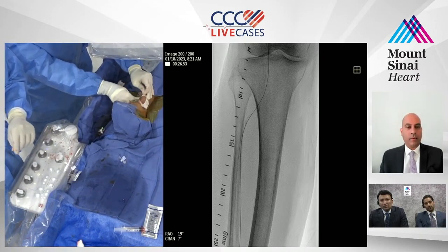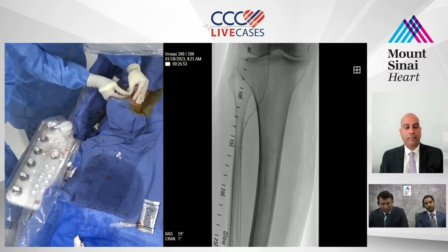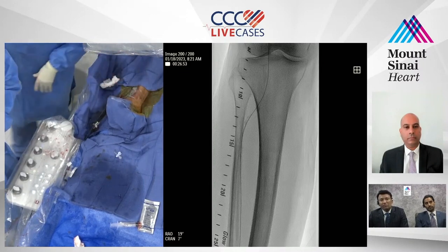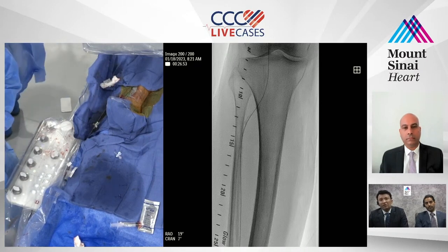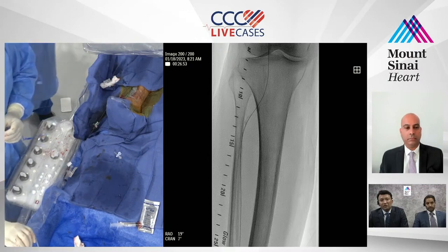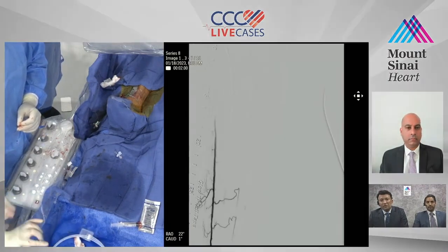Oh, no, 035. I'm saying just to define it better, like what's happening in that area, like how is the occlusion behaving? So that we can have a roadmap. Which occlusion are you talking about? No, I'm talking about the pop and the distal SFA. Yeah, well, we have a picture. Let me show you. We have a few pictures right here. Hold on. Let me cross this with everybody's help, and then we'll talk about how we're going to treat it.